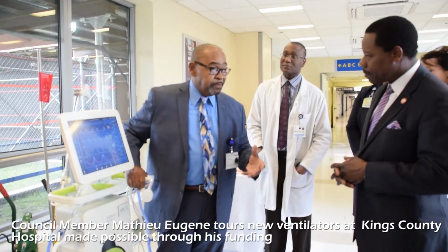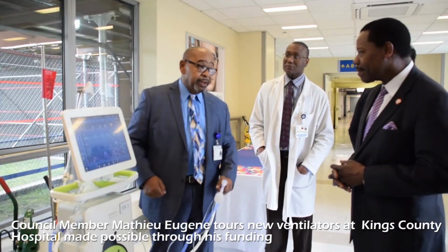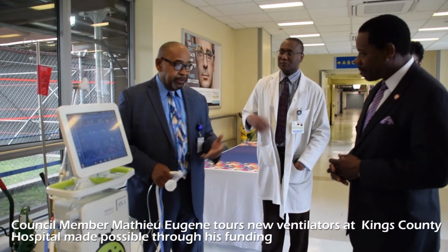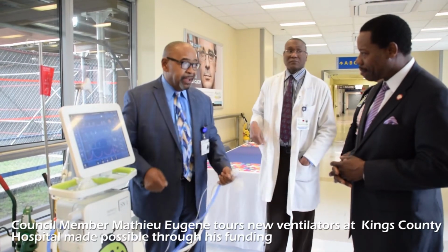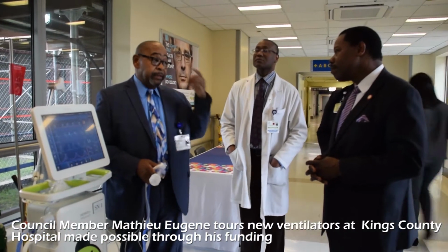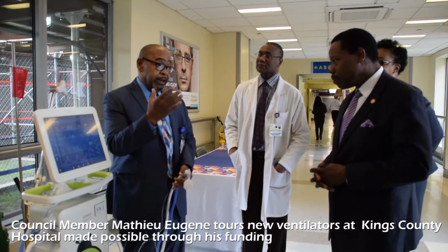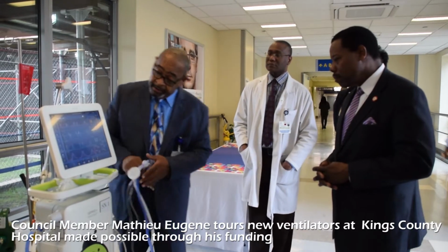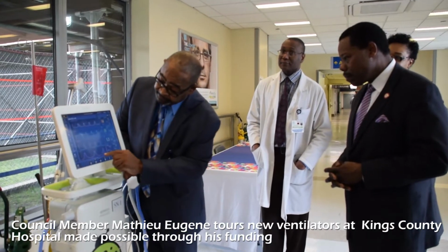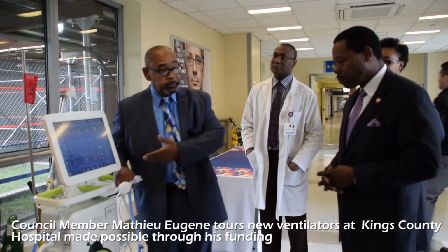So for example, when you go shopping, if you're like most guys, if you're like me, and you come home with 10 bags of groceries, you want to get all 10 bags in the house at the same time, instead of making 2 trips. And your body says, okay, this idiot's at it again, trying to bring more bags in than he should. What happens is my metabolic level is increasing, so the output of the signal from my brain increases, and it gives me a bigger breath. It causes my diaphragm to have a stronger contraction, and that's what this represents. This peak represents when the diaphragm's contracting and the electrical activity is produced, and this trough is when the diaphragm's at rest. It's kind of like depolarization and repolarization of the heart.